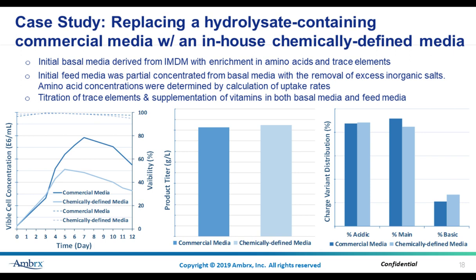The initial feed medium was partially concentrated from the basal medium with the removal of excess inorganic salts. The amino acid concentration was determined by calculation of uptake rate. Trace elements were titrated and vitamins supplemented in both the basal medium and the feed medium.